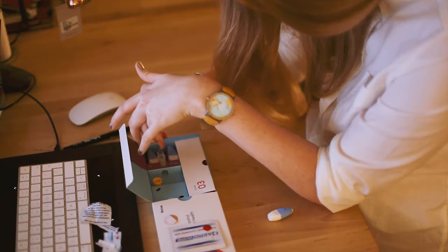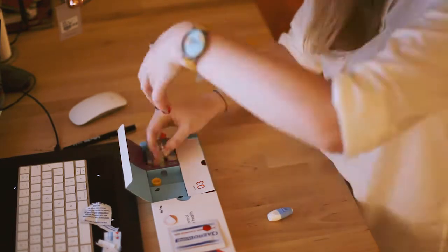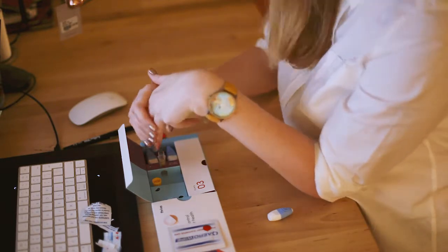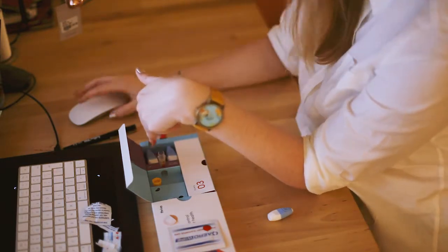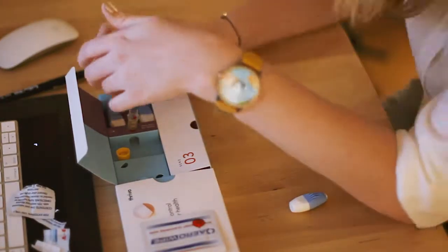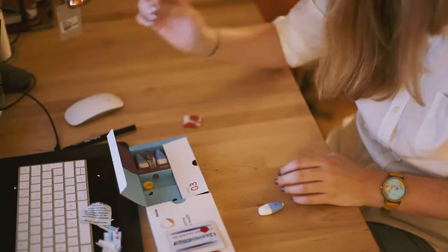Quite a lot of blood came out then but I don't know how much is going to come up now. I don't think that worked — there's like no blood in there.